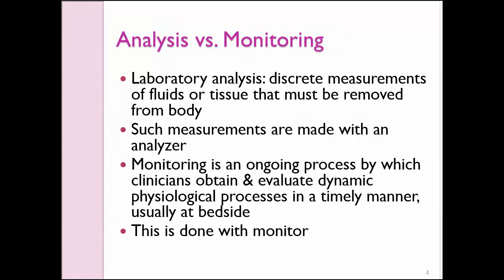Analysis versus monitoring. Laboratory analysis is the discrete measurements of fluid or tissue that must be removed from the body. Such measurements are made with an analyzer. Monitoring is an ongoing process by which clinicians obtain and evaluate dynamic physiological processes in a timely manner, usually at bedside. This is done with a monitor.